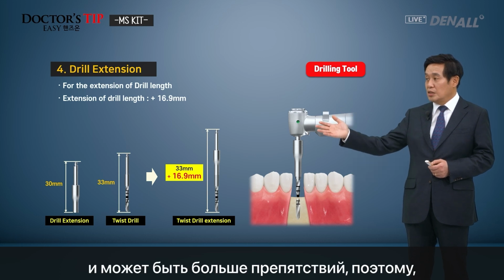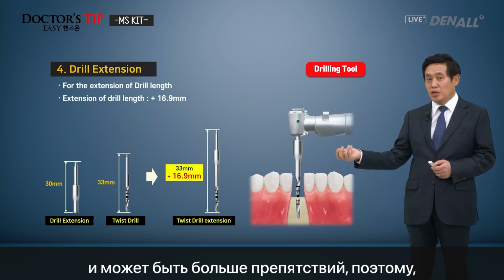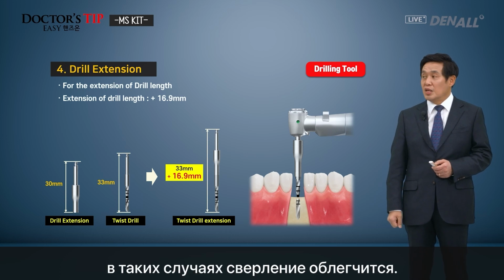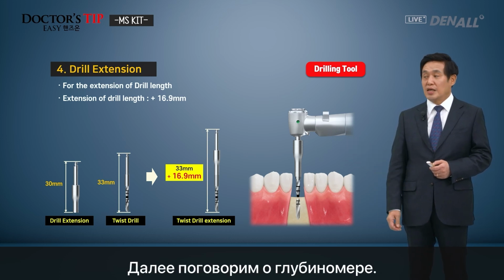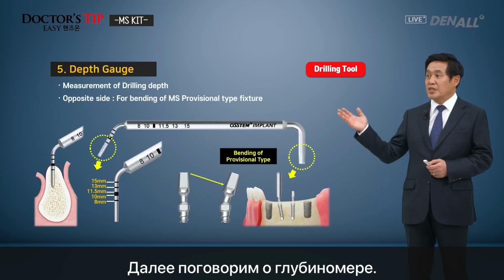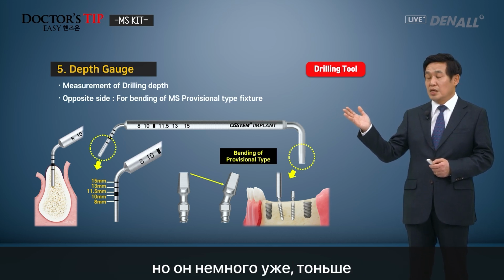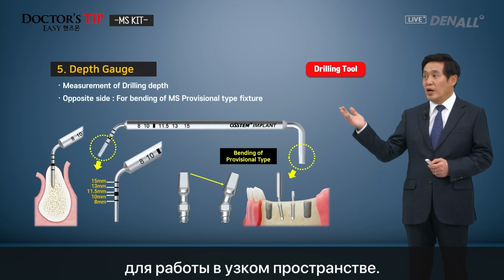The extruded teeth have a lot of bone absorption. There could be more interference. So if you use the drill extension in such cases, drilling will become easier. Next is the depth gauge. It's a basic gauge that you would know, but it's a bit narrower and thinner, because you go into a narrow space.